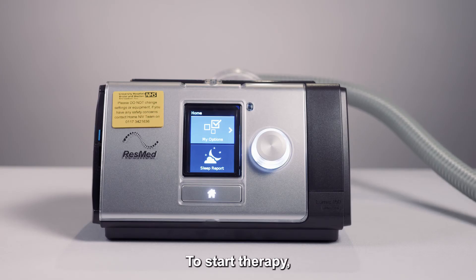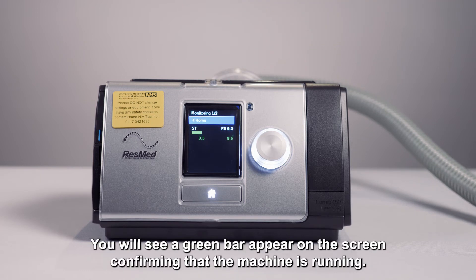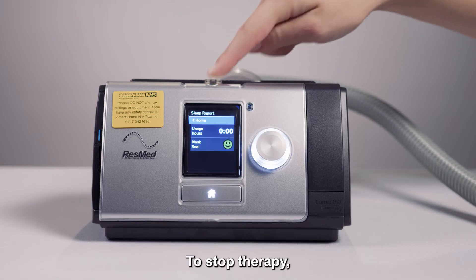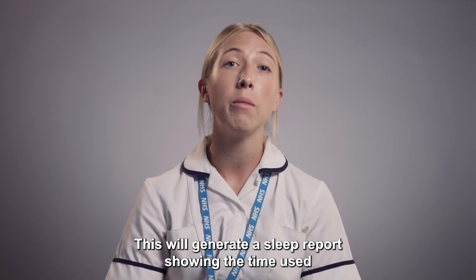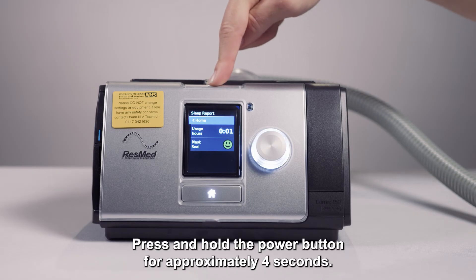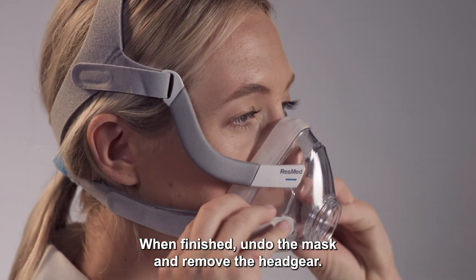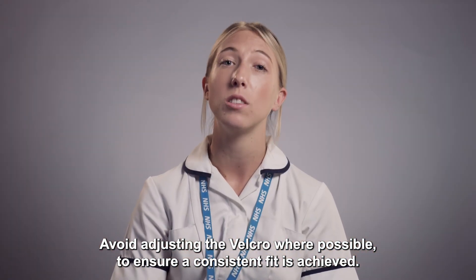Press the home button to return to the main menu. To start therapy, press the on button once. You will see a green bar appear on the screen confirming that the machine is running. You will see the bar move up and down as the breath is given. To stop therapy, press the power button once. This will generate a sleep report showing the time used and how well the mask fit. To turn the ventilator off, press and hold the power button for approximately four seconds. When finished, undo the mask and remove the headgear. Avoid adjusting the velcro where possible to ensure a consistent fit is achieved.